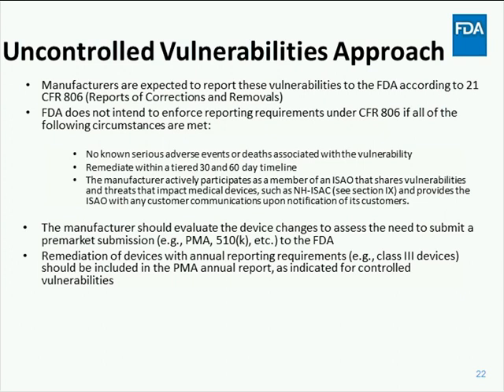The 60-day time frame was provided to give manufacturers sufficient time to validate their mitigations, which by definition includes more permanent risk reduction measures. These risk reduction measures must reduce the risk to an acceptable or controlled level. Within the 60-day time frame, remediations should be made available to customers, and given a reasonable time frame for the receipt and operationalization of the remediation. It is expected that manufacturers will be continually updating their products and therefore need robust patch management capabilities, and these capabilities should increase over time.